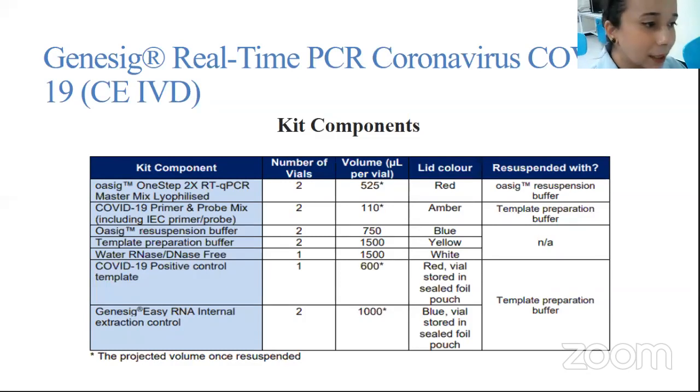I will be explaining why we will be using controls, positive and negative controls, further on.